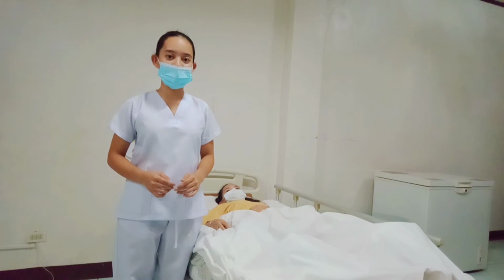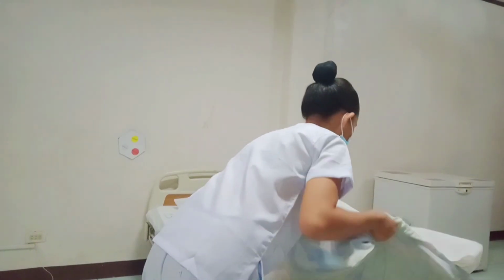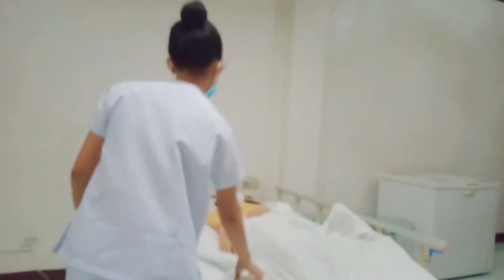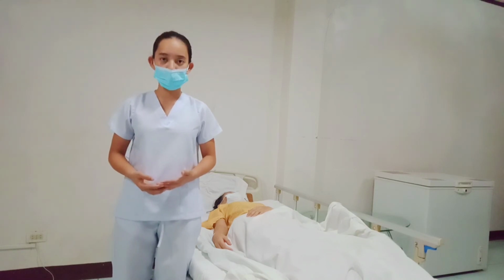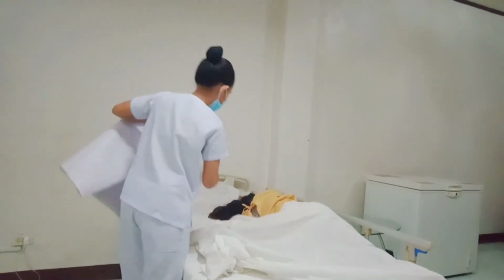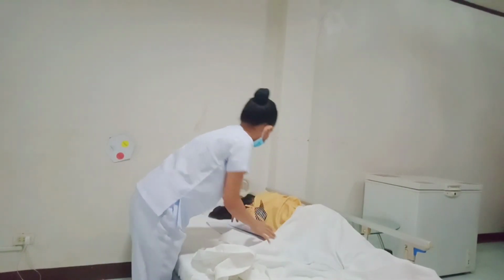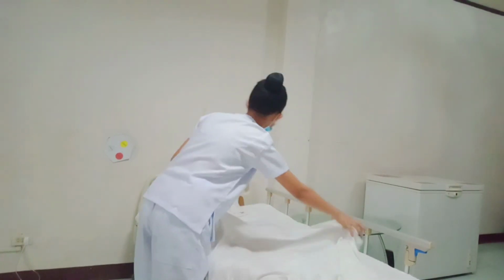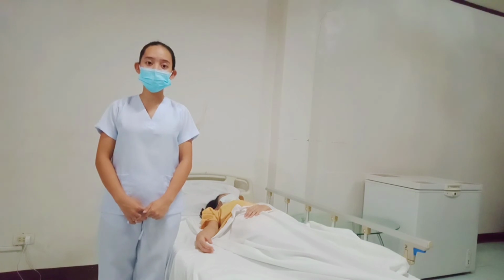Remove all pillows and place one against the head of the bed. And then, let's insert a pull sheet. So we have here an alternative to our pull sheet. Can you face them? And then, ask the client to flex the hips and knees and then position the feet.